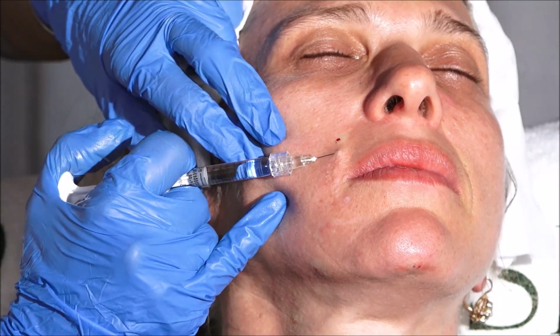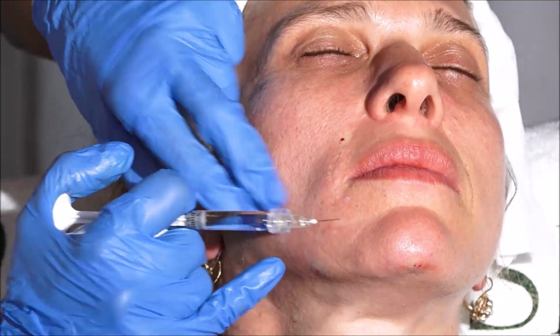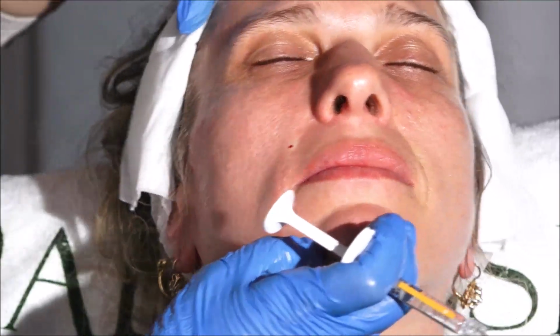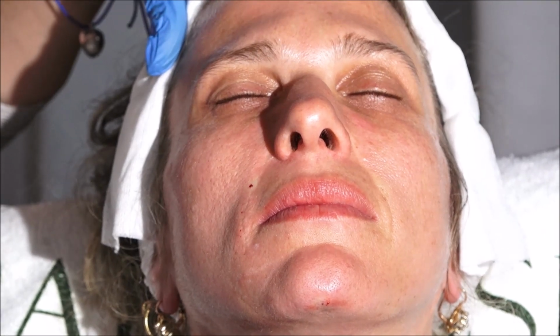And this is not what we want. So this is how we erase or we iron the wrinkle.